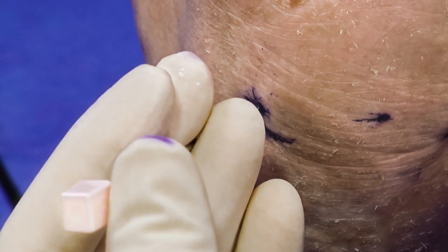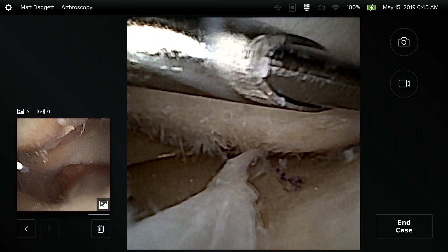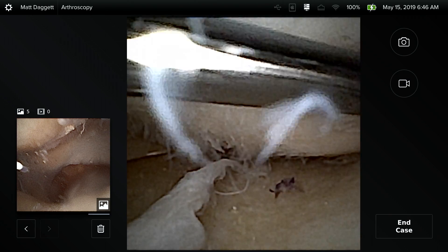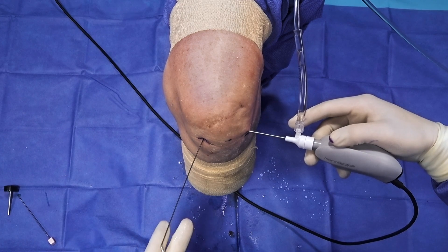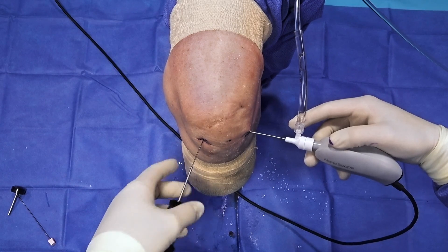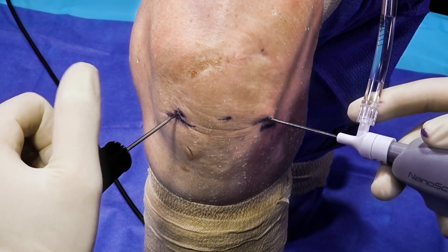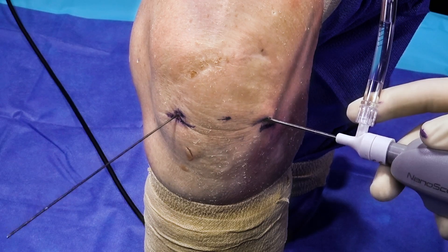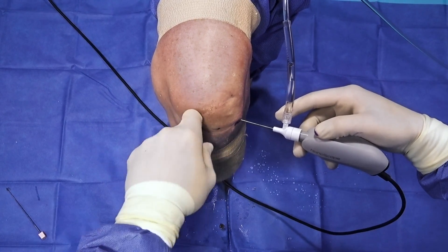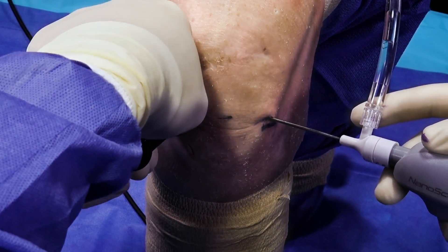Next we'll remove the stylet, insert the switching stick, and then back out the spinal needle. In some situations, it's nice to use the obturator first, as this allows for some dilation of that portal. Then we back it off and include the cannula, and it slides directly in without us having to make any incisions, which I love.